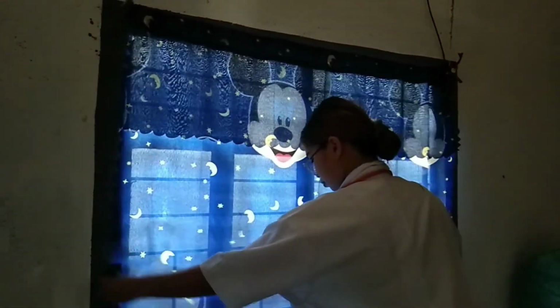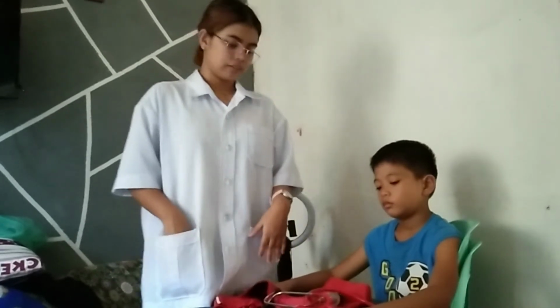So before doing the procedure, I already sanitized and performed hand washing to prevent the infection while doing the procedure. And aside from that, I also provided the client's privacy to prevent the undue exposure of his body parts. So let me start. First, we have a stethoscope and sphygmomanometer for taking the blood pressure.